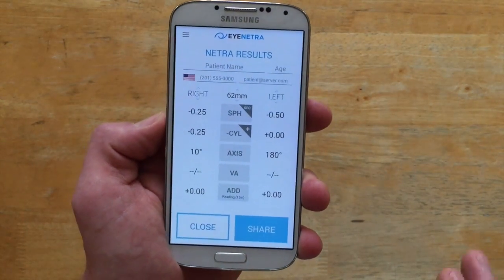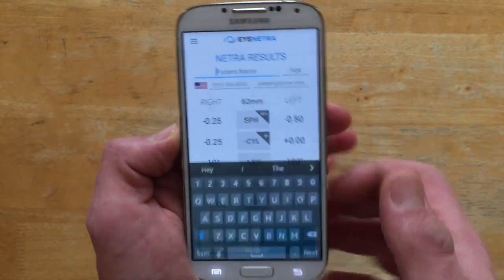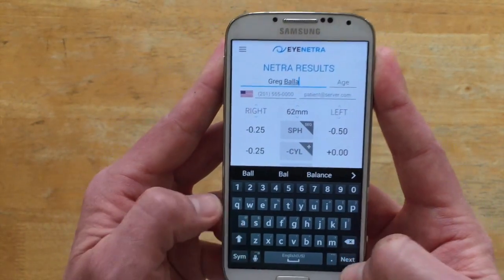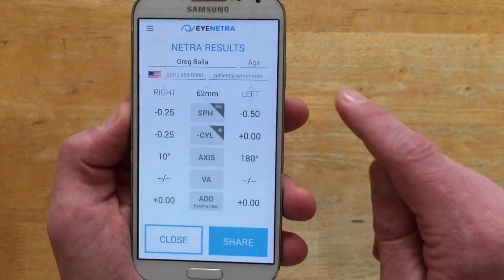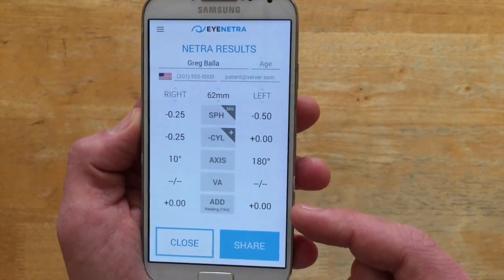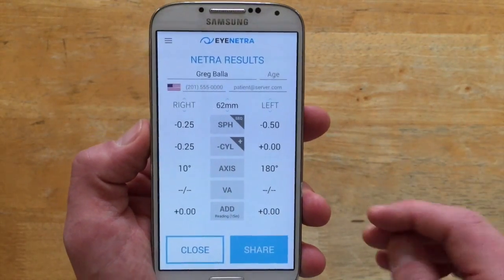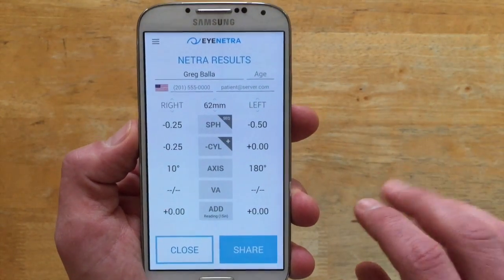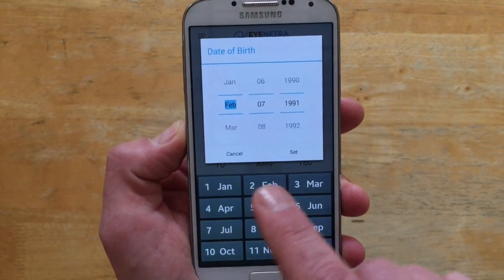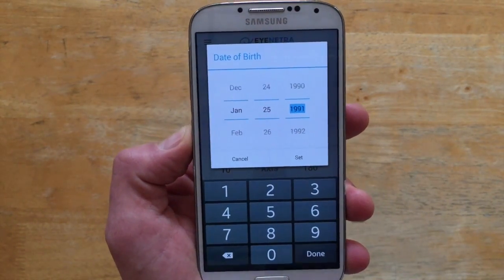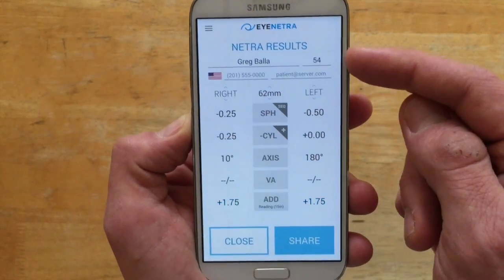The first thing you'll want to do after completing the refraction is to tag it so you know who the results belong to. In the patient name field at the top, enter the patient's name — I'll put my name, Greg. In the field next to it, enter the patient's birth date. This is important for two reasons: it will suggest an add value for progressives or bifocals, and it will also serve as the patient's login credential when they want to retrieve their prescription from the Insight portal. So I'll enter January 25th, 1965.